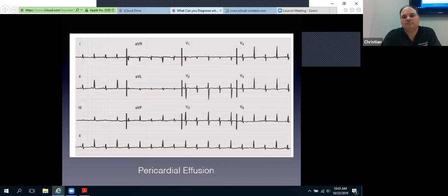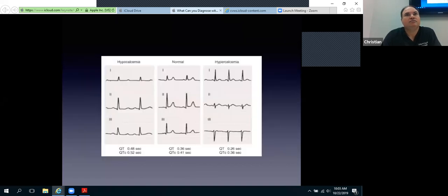Is that something you would do normally, just by reading the EKG, say calcium is high? Yeah. So there's a little bit of clinical context that needs to be applied. Not a little. I mean, there has to be a clinical context to it, right? Patients showing up complaining of palpitations, they've got a fast heart rate. I'm looking at this, and the QT intervals are very short, and they have other risk factors for hypercalcemia. Maybe they've got multiple myeloma, or they're taking exogenous amounts of calcium and so on and so forth. Then I can go, okay, yeah, this is hypercalcemia without having to get the blood work back. Like, I know what's happening there.